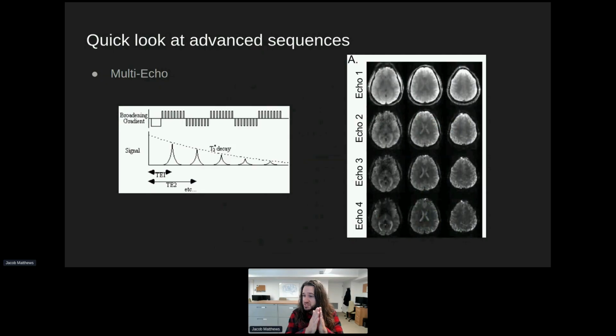We essentially have some dead space in the average EPI. We kind of activate, we do our RF pulse, and then we wait and we collect our data. Turns out that if there's enough space in that wait time, we can just collect a whole other brain's worth of data. And if you keep going longer after that, you may be able to get 4 or 5 volumes of whole brain data per RF pulse. Only one of these is going to be optimized for your BOLD signal, but your others may be useful for other things.